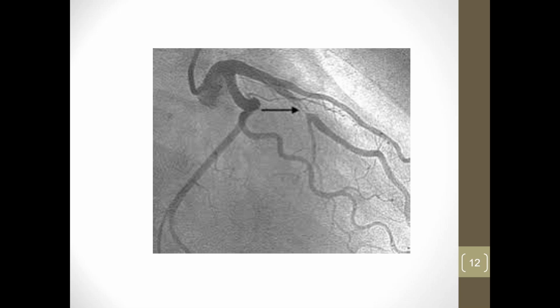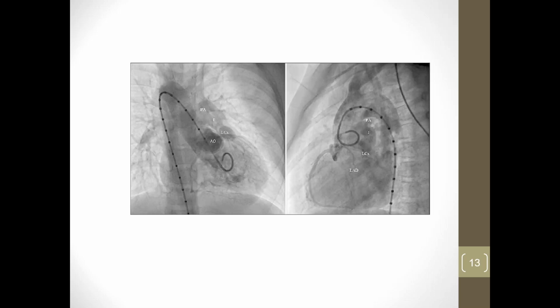So here's an example of a coronary artery that's got an obstruction. So what they will do is go in through the femoral artery, go up through the aorta, and then come up to the end of the aorta, and then drop a catheter down into the arteries and start looking for any blockages or narrowing, depending on the problem. Again, I'm sorry for the image quality.